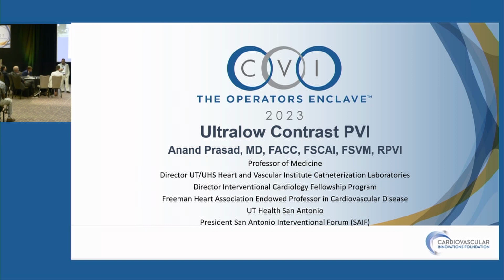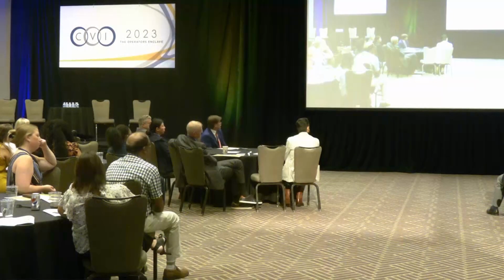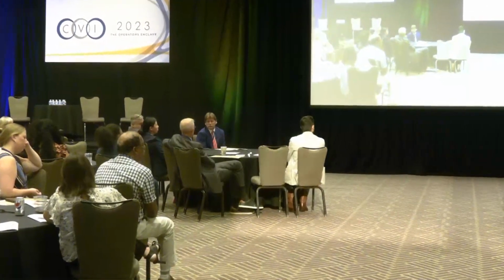Fantastic. Thank you. Anand, great talk and great discussion. One quick question for the panel. I do want to come back to Chris's case, where he showed a lot of bailout strategies planned in advance. The radial to peripheral field is advancing very quickly, and new devices are coming into the market, and Sameh showed some great cases. I would address this directly to Peter and Jun. Jun, do you at your institutions do R2P interventions, and are the labs appropriately stocked to do it in terms of both planning and also bailouts?